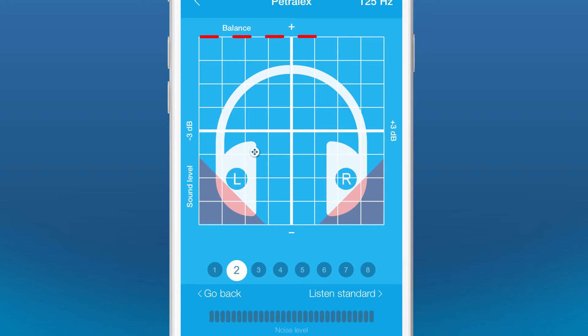This is the limit beyond which there is a zone of discomfort. Don't cross the limits of the red zone of lower thresholds.